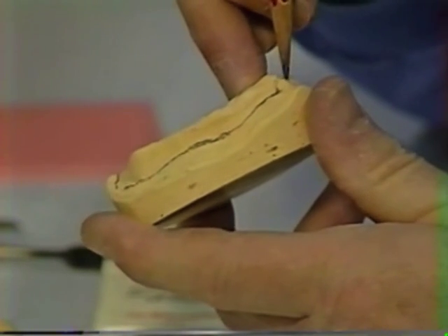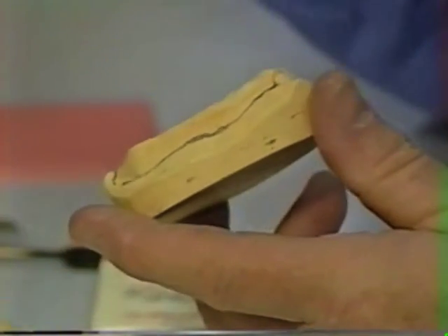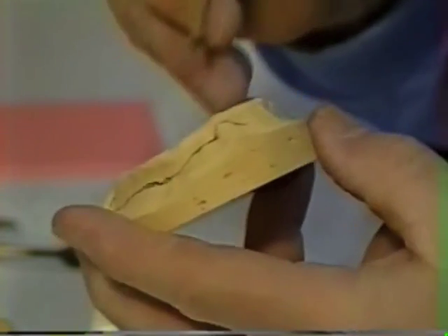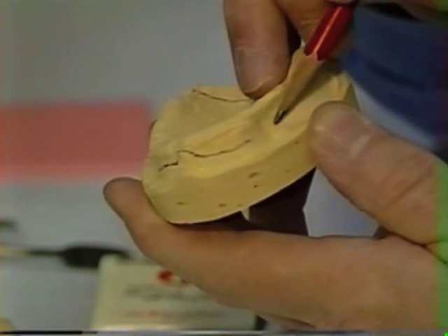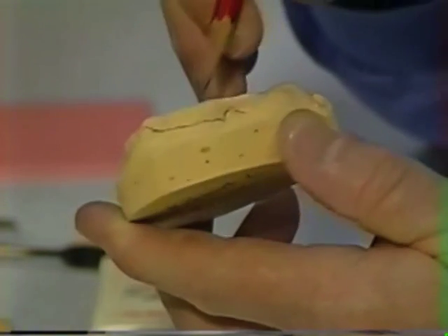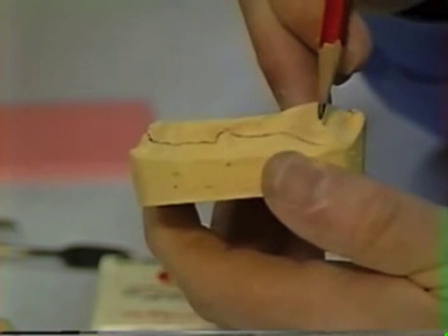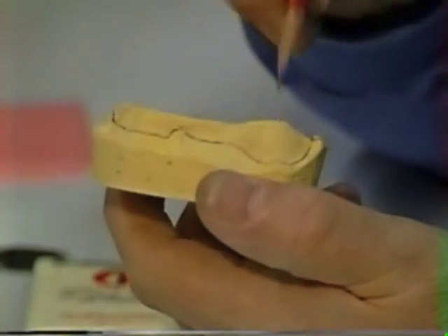As far as the mucolabial fold in the area of the central incisors and lateral incisors, they had a very heavy buccal or labial frenum, which we want to skirt about like so. And then we're going to come around the other side and do the same thing. Look right here, we can actually see the little buccal frenum coming up, so we want to skirt that buccal frenum and put a notch to allow for play of the buccal frenum in that area. Here's the zygomatic arch. We don't want to get up onto that zygomatic arch, but we can allow the tray to go all the way to the depth of it in the buccal space area, that space just lateral to the tuberosity.